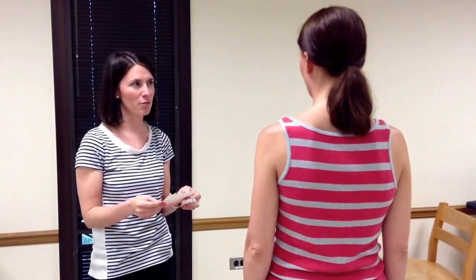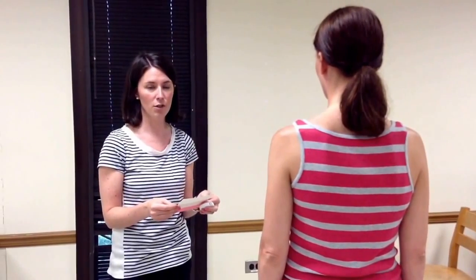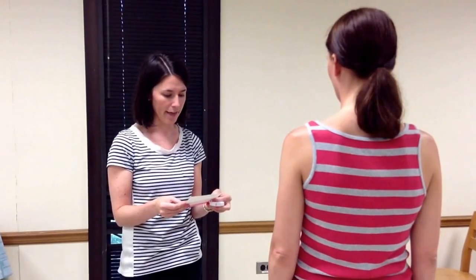Now we're going to do range of motion measurements for trunk side bending, or lateral flexion, whichever one you want to call it. Trunk side bending occurs in the frontal plane. When we use our tape measure, there's no normal value, but when we use our goniometer, the normal value is 0 to 35 degrees, and the end feel is firm.